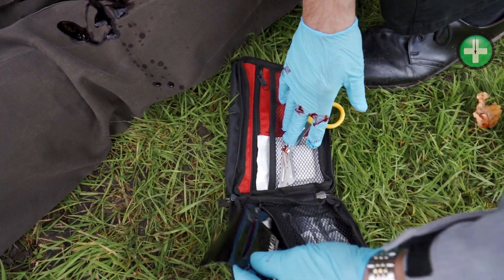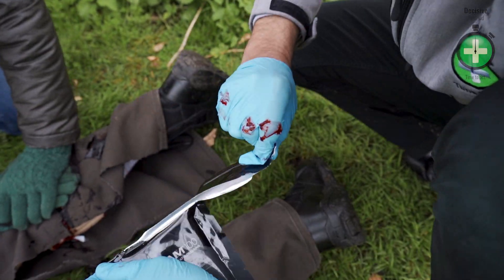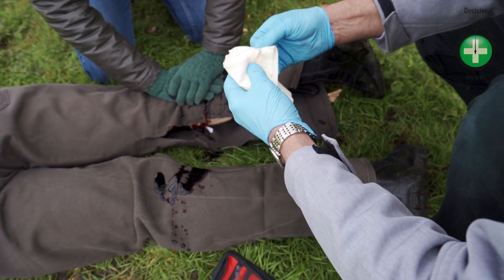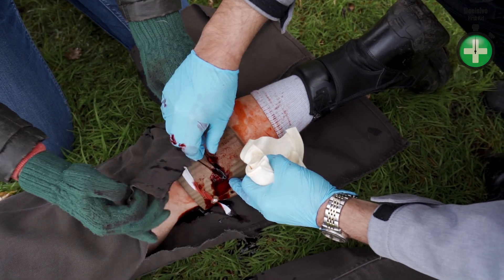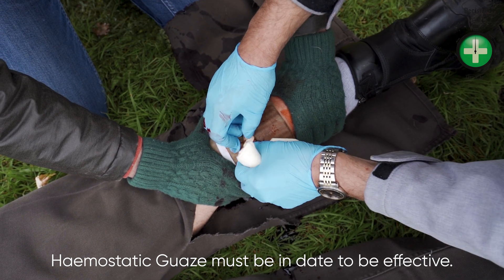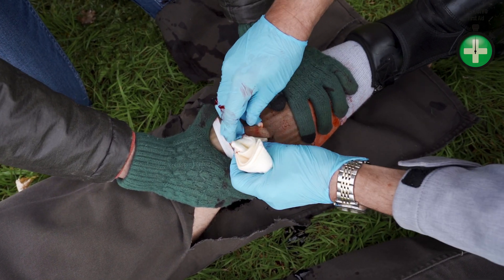Cliff, I'm getting out the haemostatic gauze — I'm just tearing away the packaging and pulling it out. I'm ready. Take your hands away. Let's look at the big open wound. There it is. I'm going to feed this dressing in, forming a plug with it. Get that into the wound.